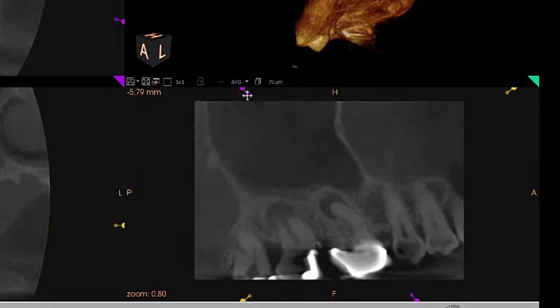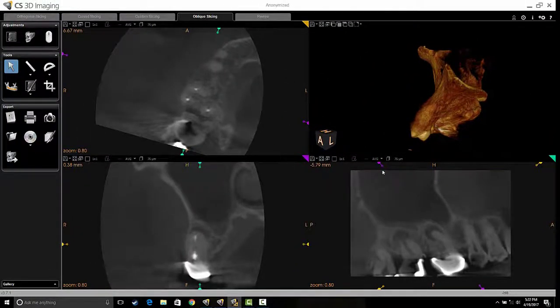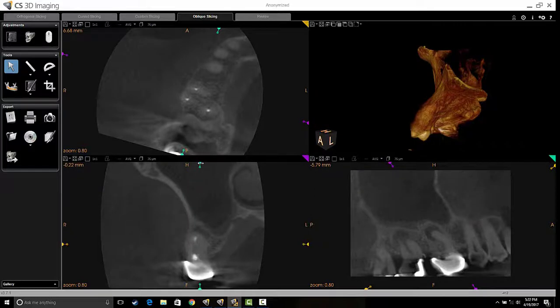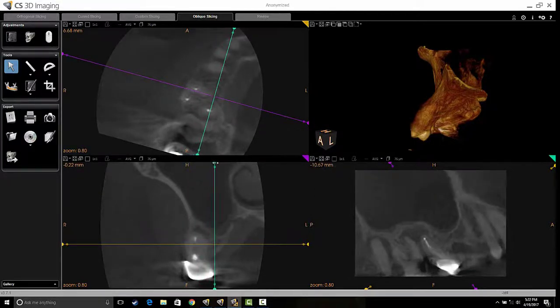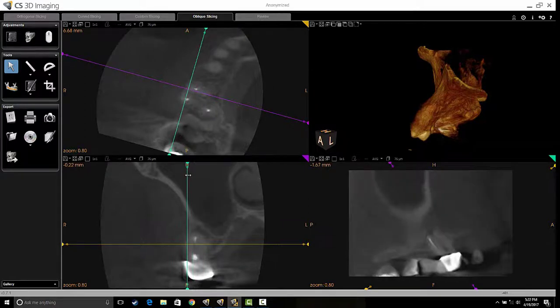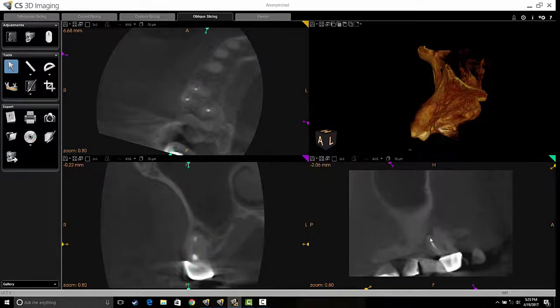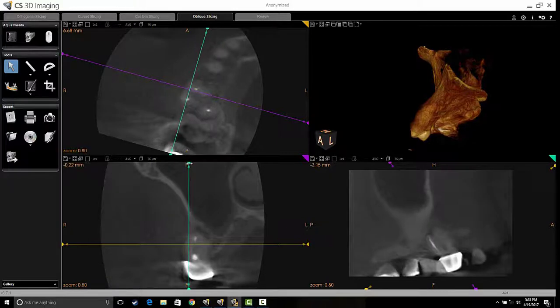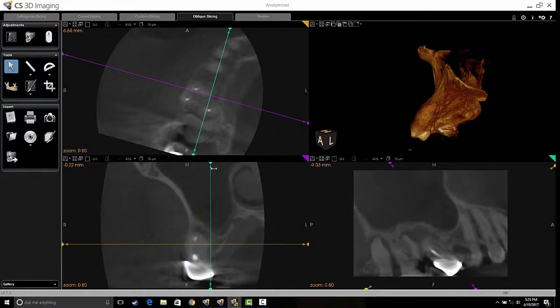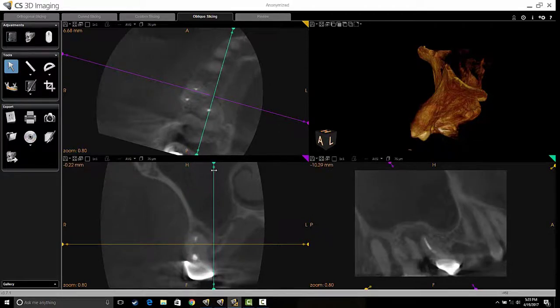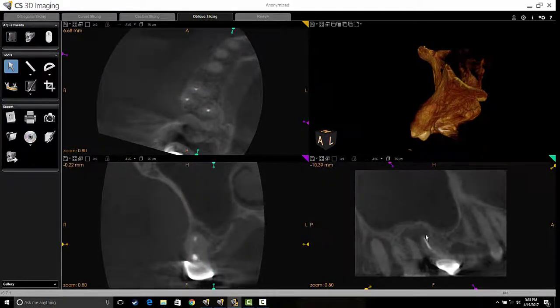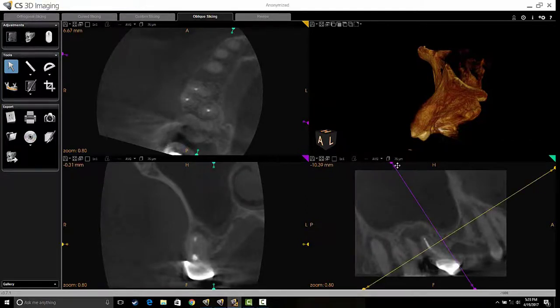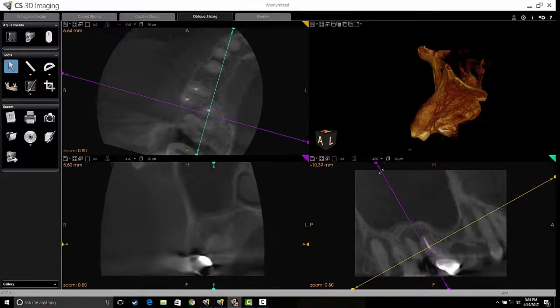As I'm going through the scan, we're picking up little bits of information on multiple different areas. Moving palatal now to get a good view of the palatal root and the distal buccal — here's the distal buccal of tooth number three, which may have a small area associated with it. As I move palatal, we're going to look at the palatal root, and you can see that this area of apical periodontitis is continuous with the mesial buccal root, or maybe even mesial palatal because we're all the way back here. It gets a little confusing — there's a lot going on in this particular scan, which is why I'm using it as an example.